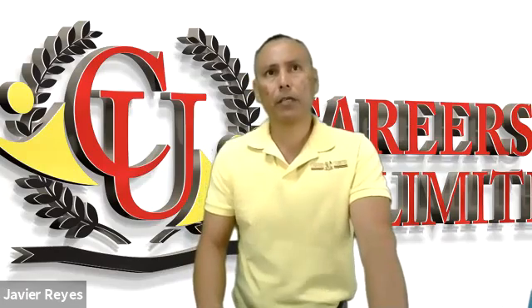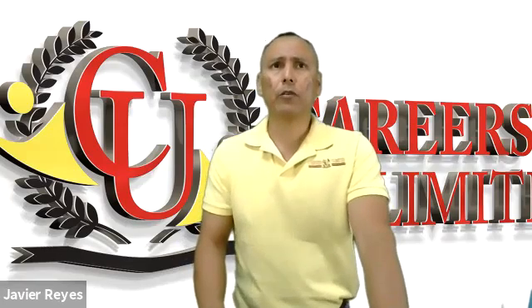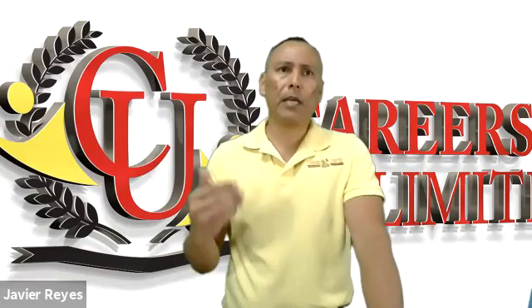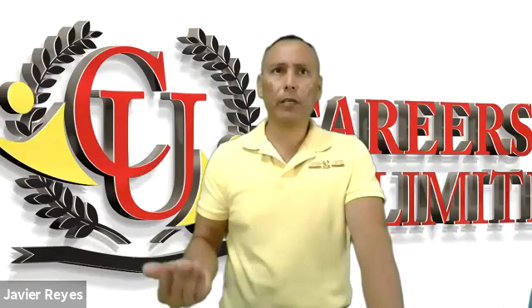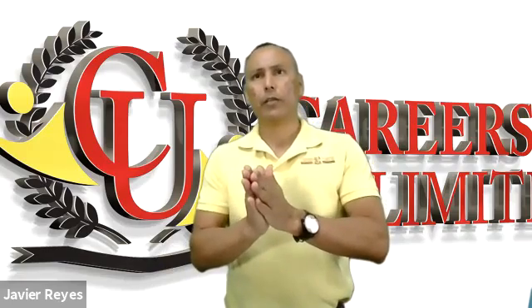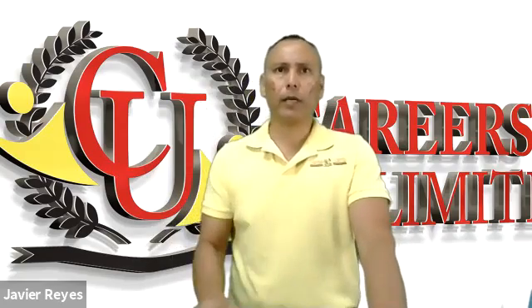Another possible complication that may occur during the procedure is fainting. Now, fainting doesn't occur often, but it can occur. So you always want to make sure that you ask a patient about a history of fainting or a history of fear of blood or fear of needles that may cause them to faint. Okay, fainting is a loss of consciousness, and usually their posture changes. Sometimes their blood pressure drops. Fainting is usually caused by insufficient blood flow to the brain, and that's the only reason.